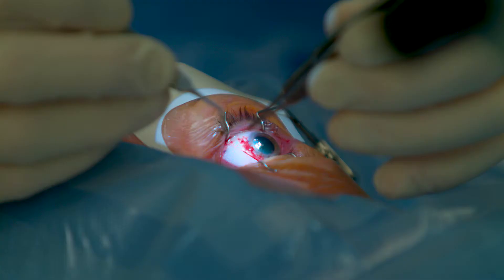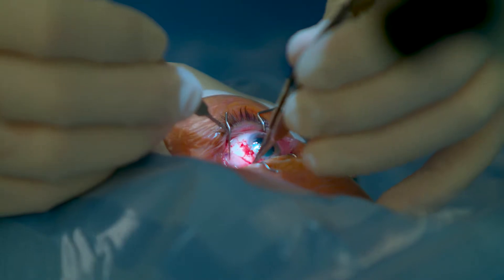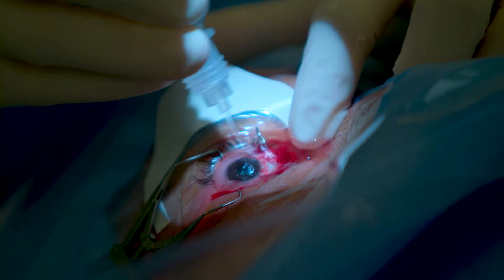So we address all that — Tenon's — and then the key during the surgery is mitomycin C: apply it posteriorly, then we irrigate and then apply the graft, tucking it in posteriorly and sizing it right on the field.